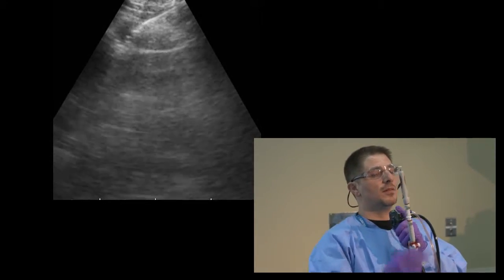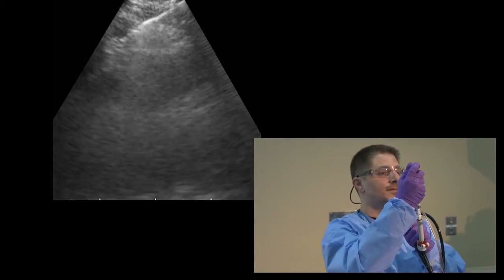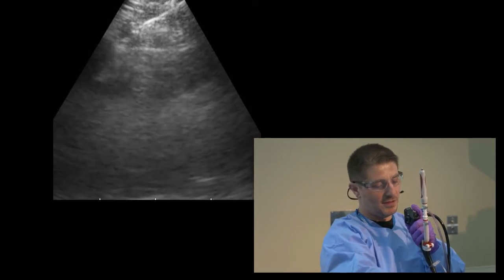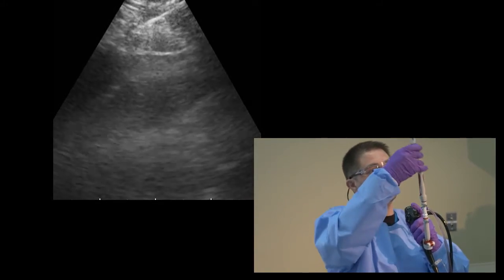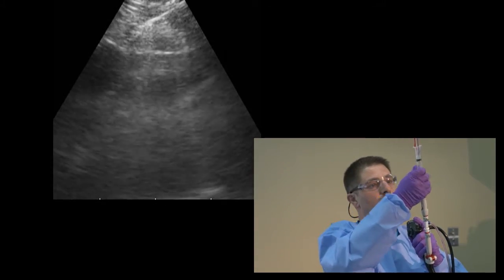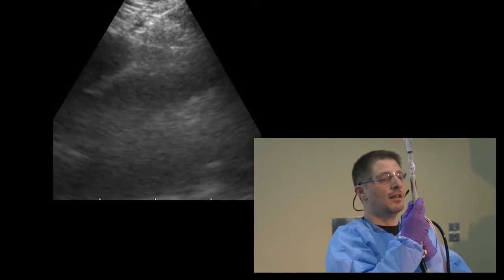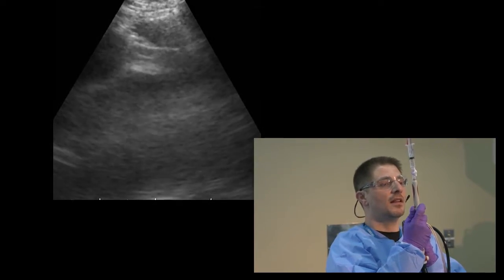push the scope a little bit. Can you hold the scope, Nina? We pull the stylet, I'll give it to you, hold it there, suction. You put the suction, you activate it by turning, and then sample the lymph node.